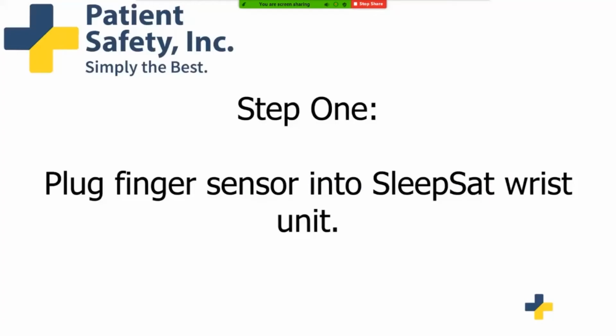When you're ready to fall asleep, step 1, plug finger sensor into SleepSat wrist unit.